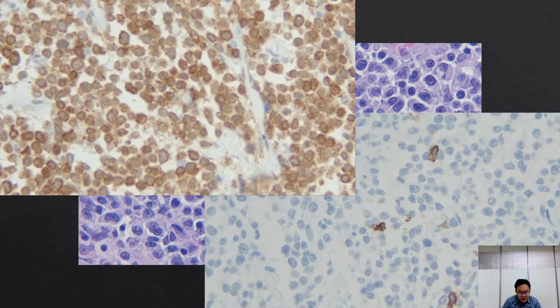What we get in this case is that these cells show a positive stain for B cell marker, like this picture here. The cell marker is CD20, indicating that all of these cells are B cell origin. Whereas when we do the T cell marker CD3, you can see almost no staining, like this picture. So we combined together to determine it's not just lymphoma, it's a B cell lymphoma.